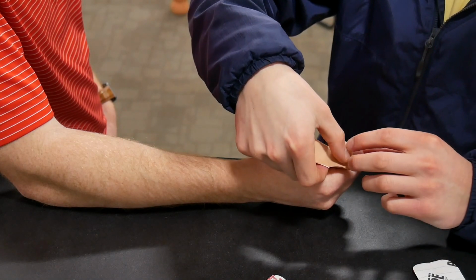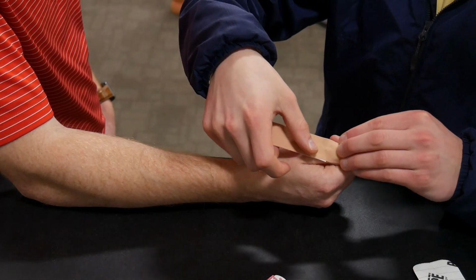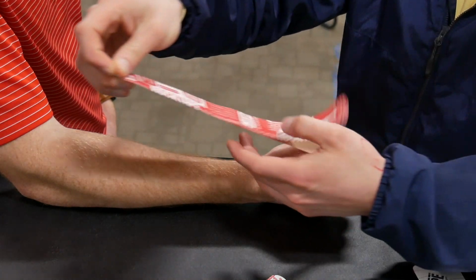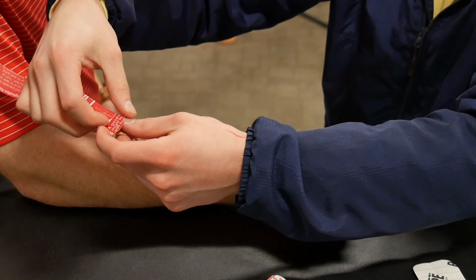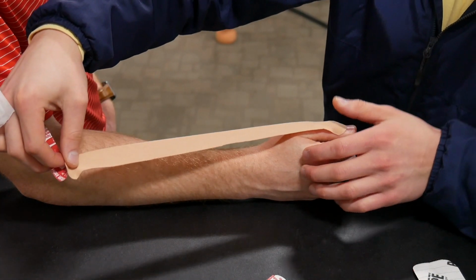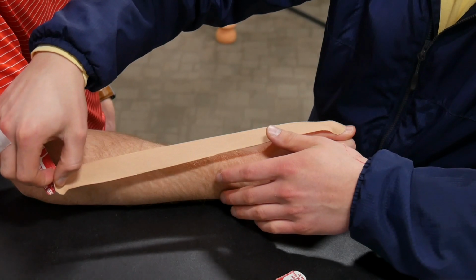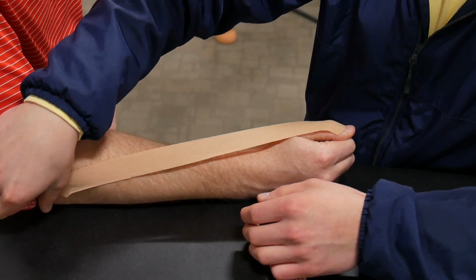You want to put that on, press it down, rub it in to activate that adhesive just to get it nice and anchored. And then you're going to bring the tape up. You're going to pull the rest of the paper off except for about the last inch or two, just to give yourself a handle to hold on to. Then you want to follow the tape back around towards the lateral aspect of the elbow, not all the way to the lateral epicondyle necessarily, but in that direction. Put a slight stretch, maybe a 50% stretch there, and anchor that.